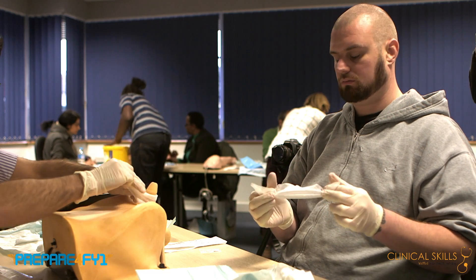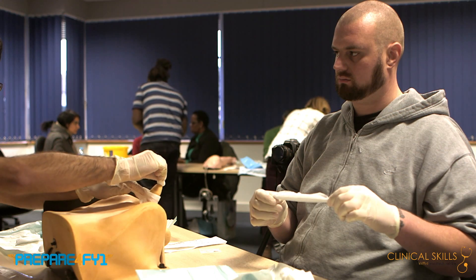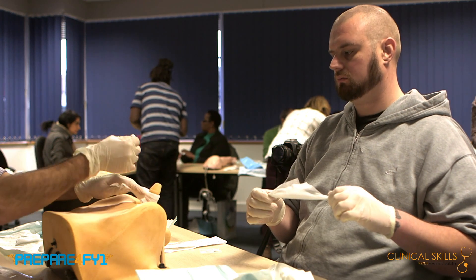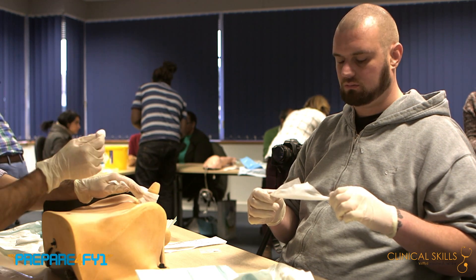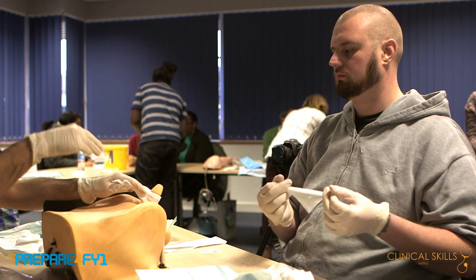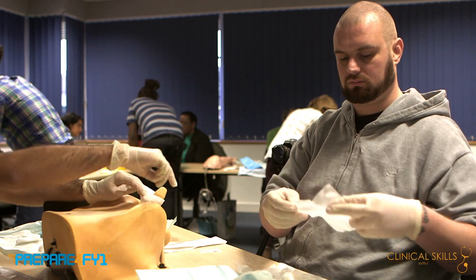When you're cleaning, you have a pair of forceps and you clean around the urethral opening, around the meatus — like you're removing eye makeup, just once. You wouldn't want to move it around because you end up with panda eyes. Get rid of it — do not put anything back onto your sterile field because that will make it dirty. You'd clean that with all of the swabs.